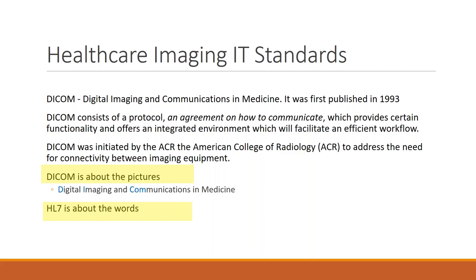So the DICOM standard is what made it so that those viewers could launch in different systems, because this was the standard. These two highlighted areas are what I want you to make sure, if you're taking notes, that you mark down. DICOM is about the pictures. Remember, it's the Digital Imaging and Communications in Medicine. HL7 is about the words.